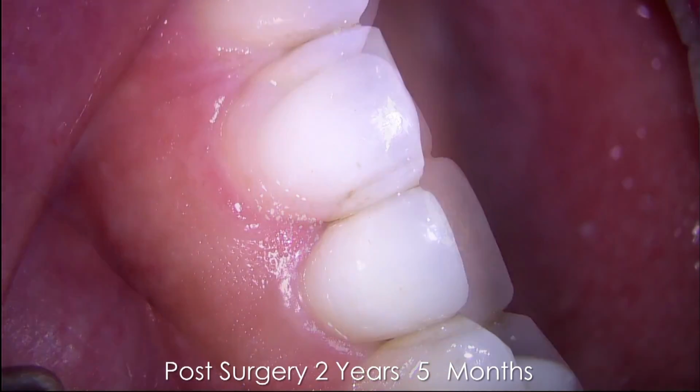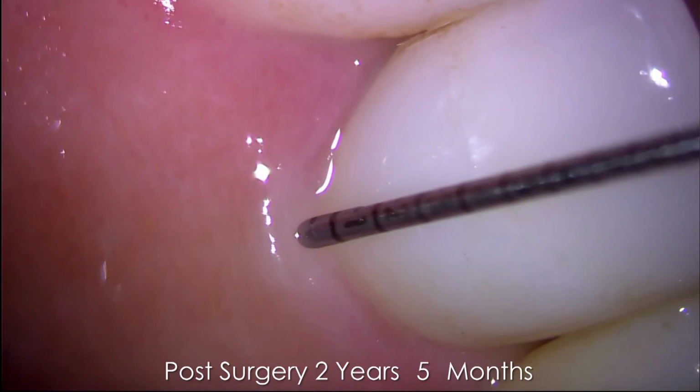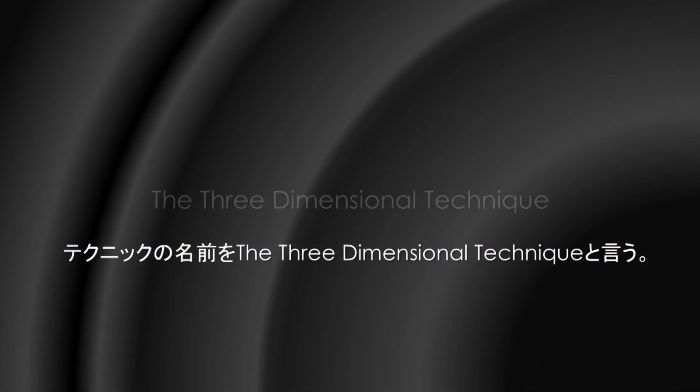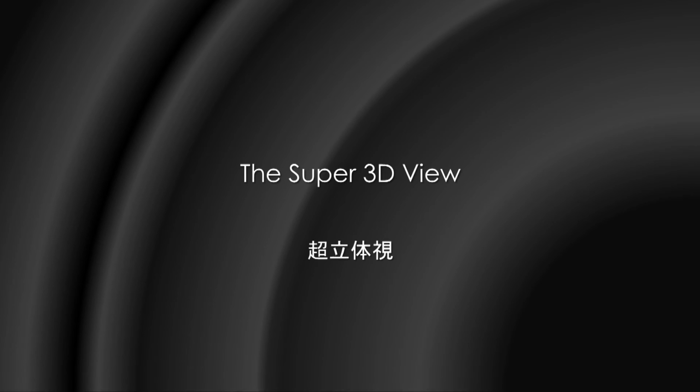This is the right upper, post-surgery 2 years, 5 months. Result: very good. Beautiful papilla. The three-dimensional technique. This is my technique based on the microscopic technique. The three-dimensional technique is the next stage in the surgical microscope technique. The Super 3D view.